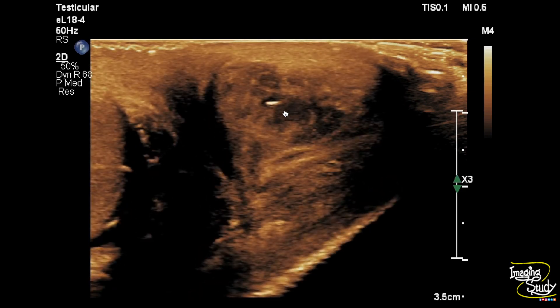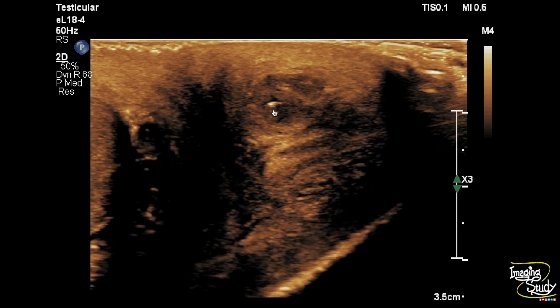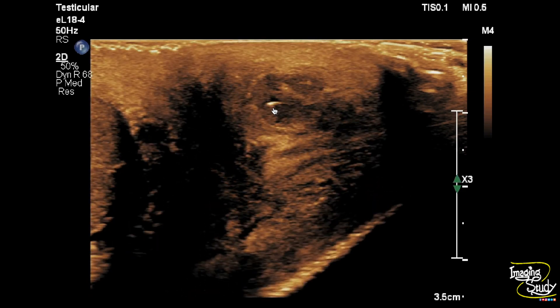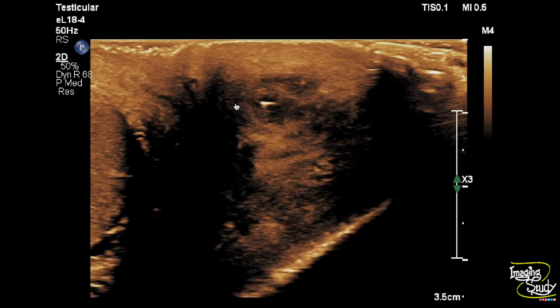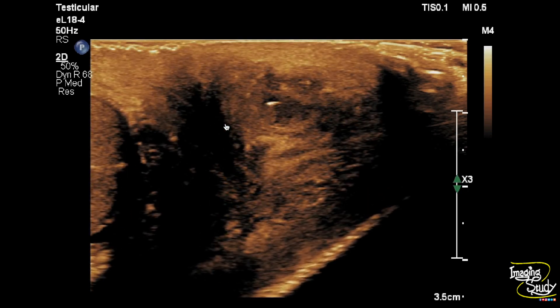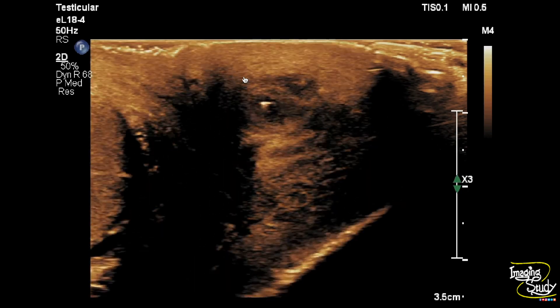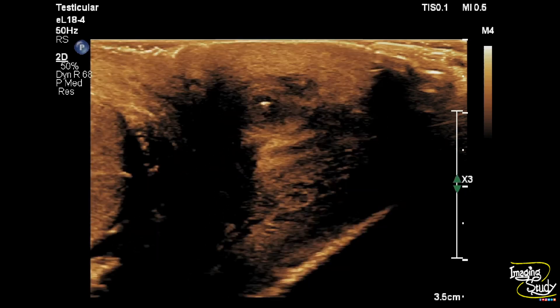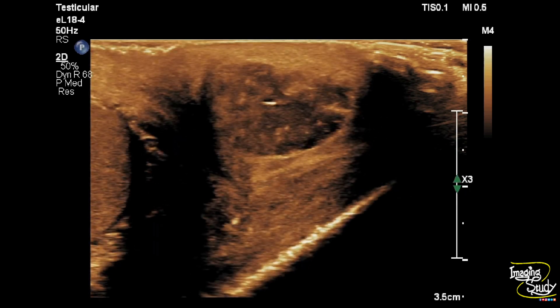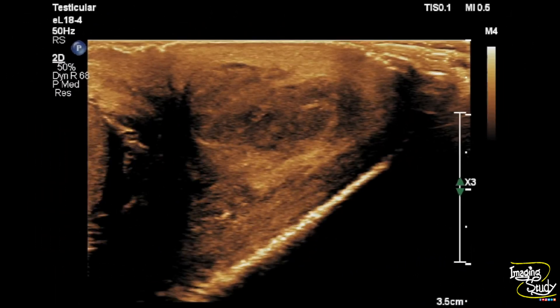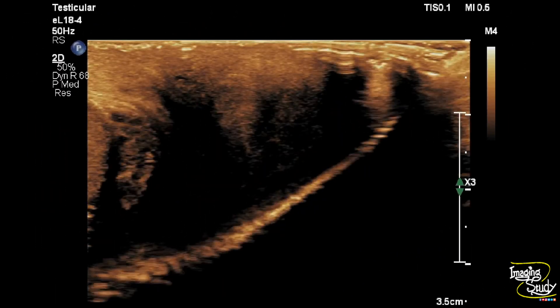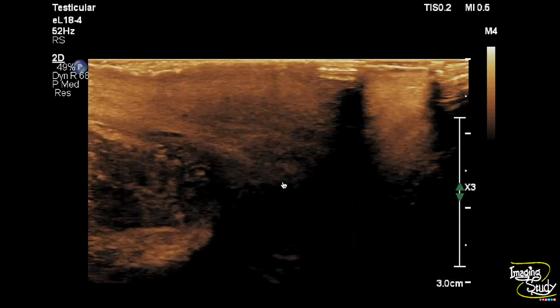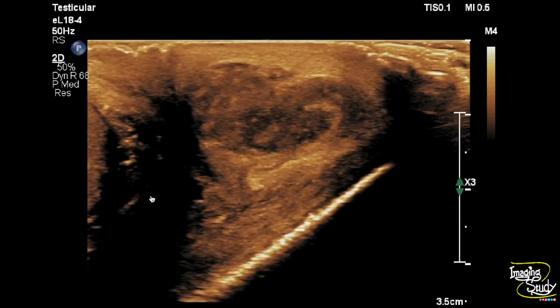Here you can see the transverse section and still you can see this echogenic focus with some reverberation artifacts. The surrounding hypoechoic zone is also well visualized here. Here again we are seeing the surrounding hypoechoic area. There is no communication with the scrotal cavity.